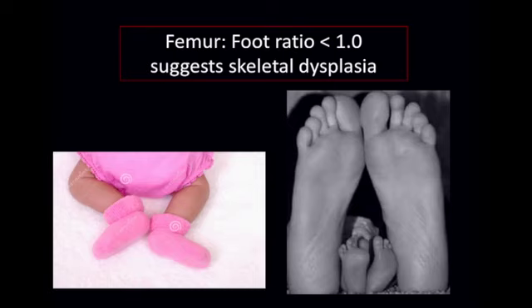And here is a picture of a cute little baby to show that there's the foot length, and roughly from bottom to knee is the femur length, and you can see that these are actually much more in proportion in an infant than they would be in an adult.